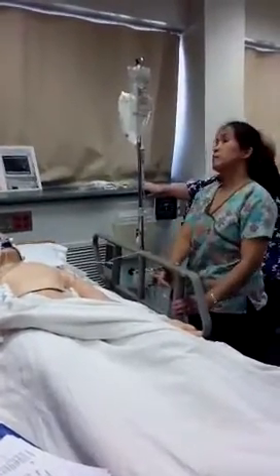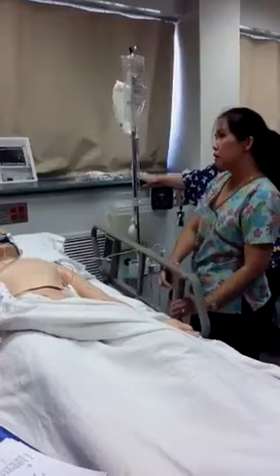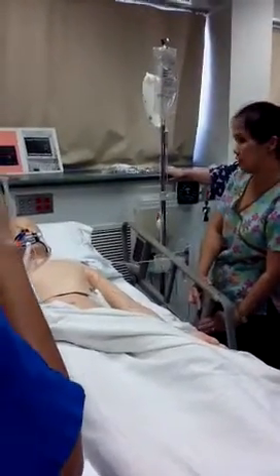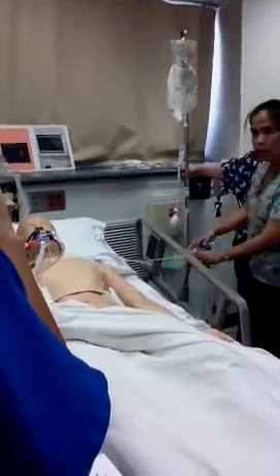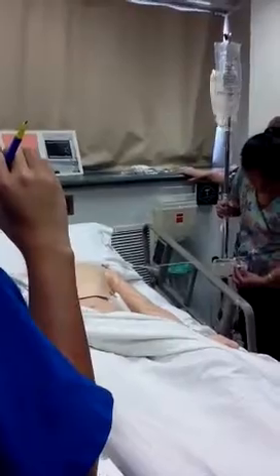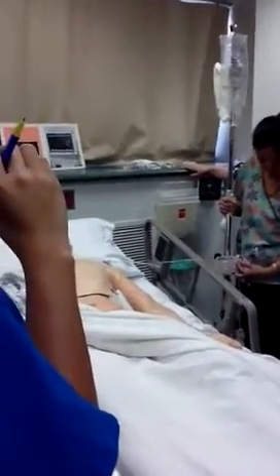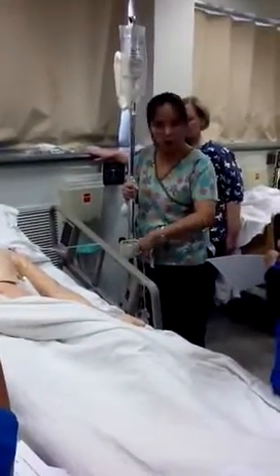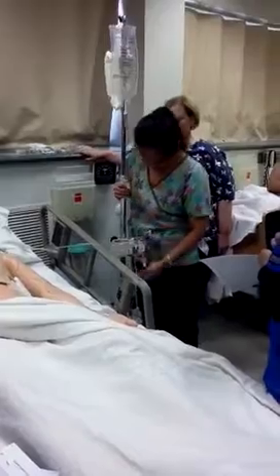So to zero it, you turn the stopcock. When you turn the stopcock, you're turning it off to that side. You have to think a little bit about it: you're turning this part off. It's the red one. So when you turn the stopcock, you're turning this part off. This is the patient right here.